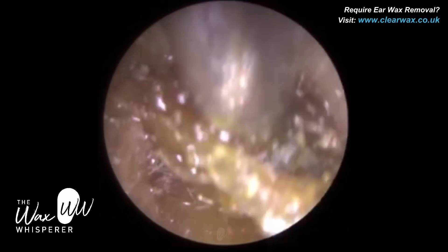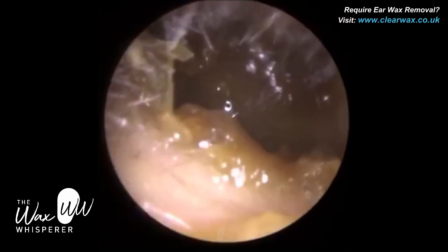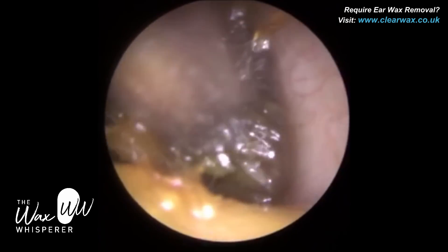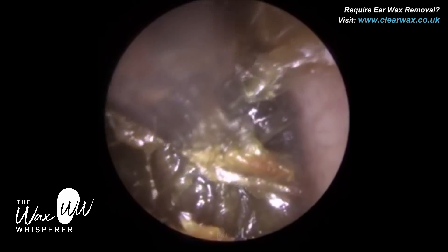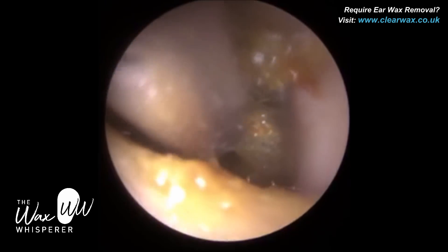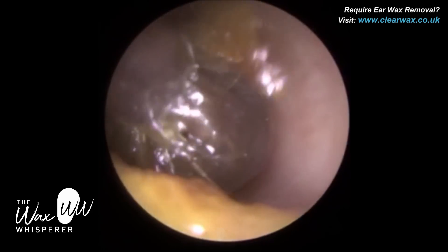I gave her a good ticking off today because both ears are fully blocked — extremely impacted — which makes it much more difficult to remove. That's why I put some olive oil drops in right from the offset. You can see the patient has some keratin and she was experiencing some clarinetting. As soon as I got the clarinetting, right at the beginning, I withdrew the suction probe and put some oil in just to soften it.